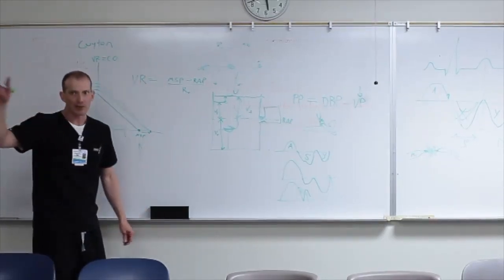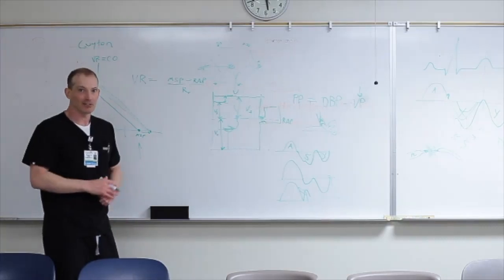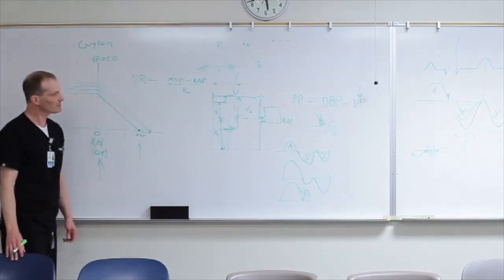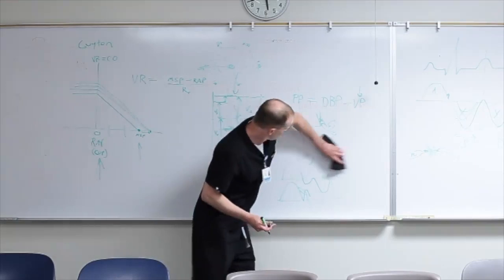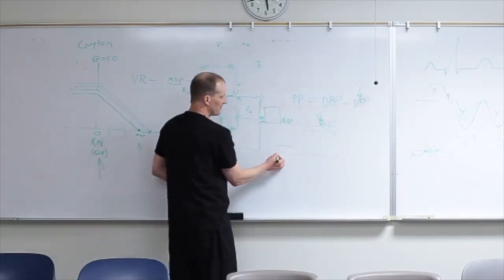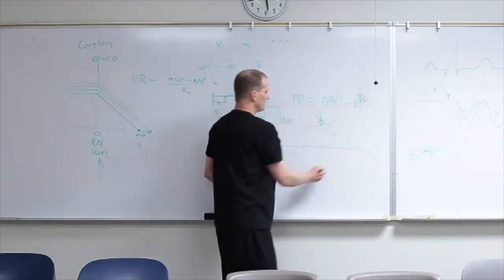So if we see a pulsatile portal vein in someone with a big fat IVC and a blue-red hepatic vein, that person probably has gut edema, and there's some inflammation getting released that's just going to make things worse. The other thing is bacteria can get translocated and wind up with bacteremia too from puffy guts. So what does a portal vein look like? So the portal vein normally will have a nice kind of above the baseline sort of hum, okay? And if you get your Doppler angles just right, it's about 20 centimeters per second, okay?